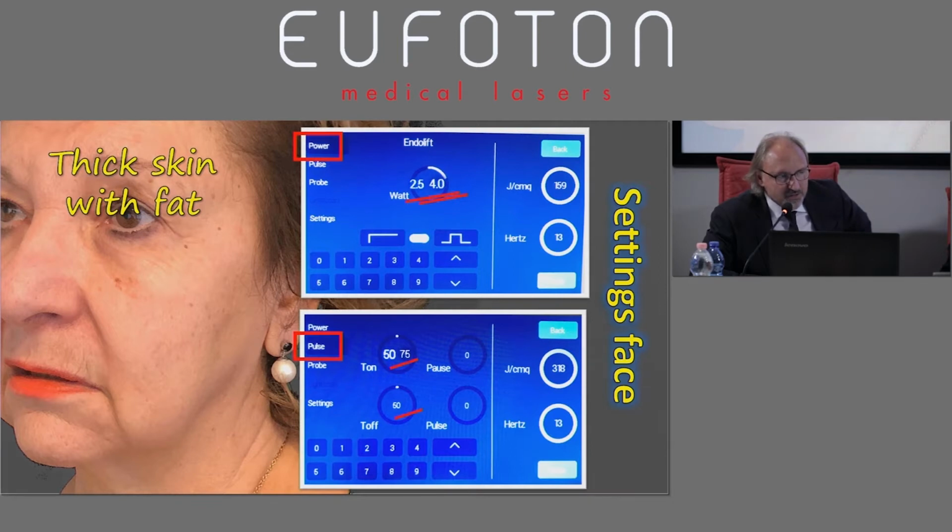In my experience I have no scientific data, I have no histological findings. I can just give you a general review of more than 1,000 procedures over 3 years of time. The empirical gut feeling is that lipolysis starts around 50 milliseconds, up to 75, up to 100 milliseconds.